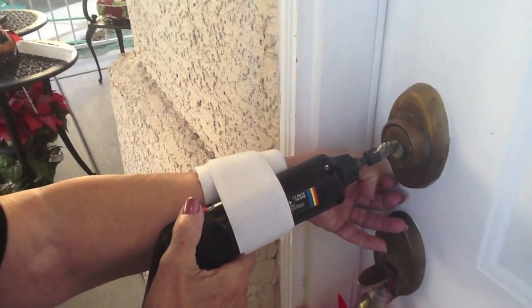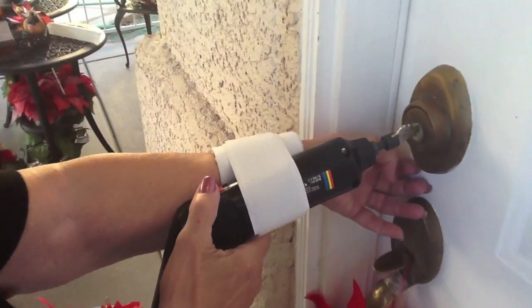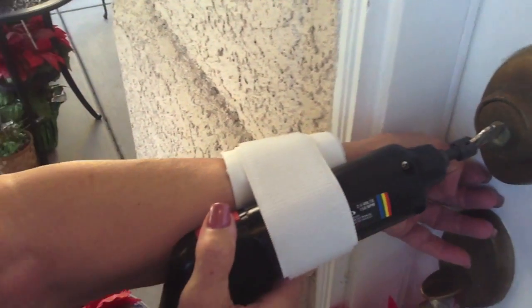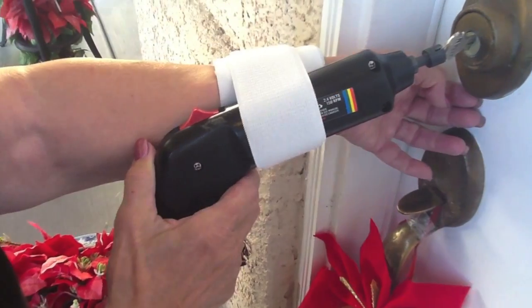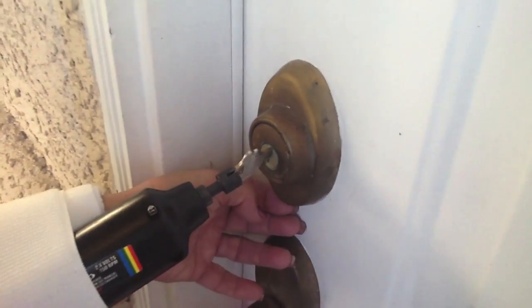So basically, this device unlocks and locks the door by using a wrist brace to make it not heavy, and by using an automatic key turner to actually turn the key.